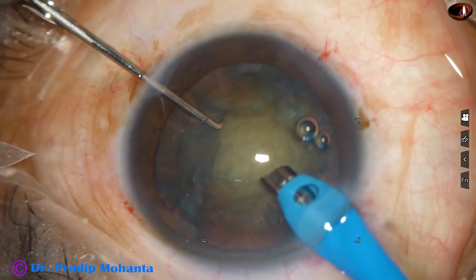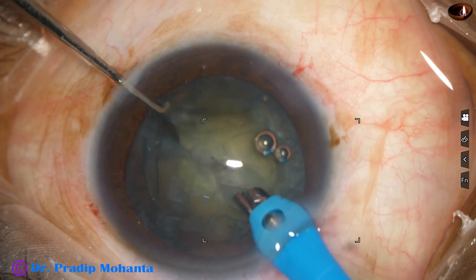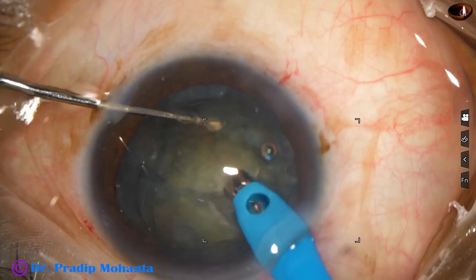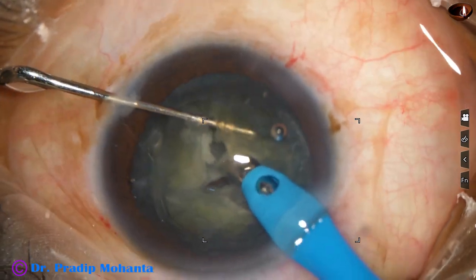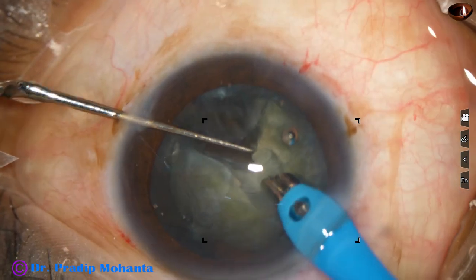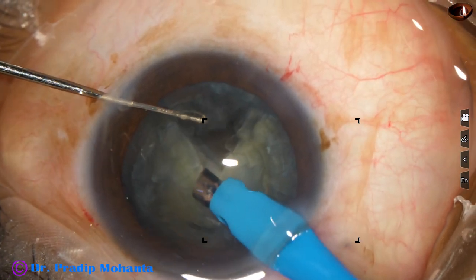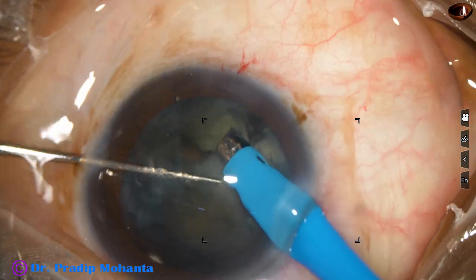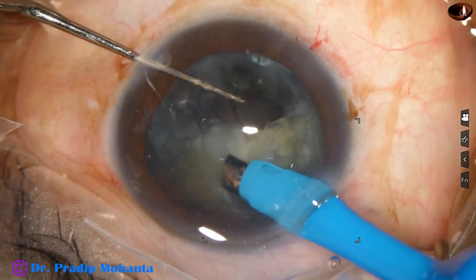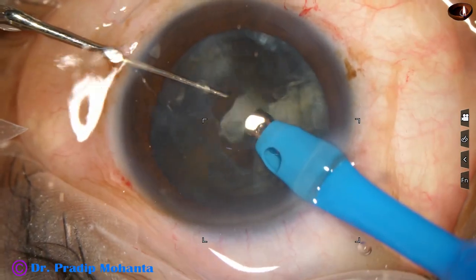I have introduced the phaco needle and I am trying direct chop. I have never used a chopper from 4 o'clock, but in this case I am using it because the dehiscence area is right at 2 o'clock. I did not have much problem using the chopper through the 4 o'clock stab wound.